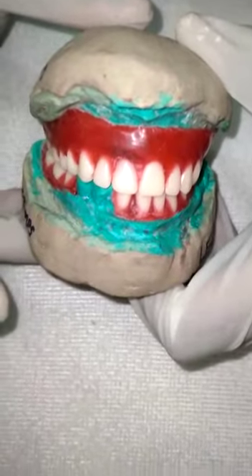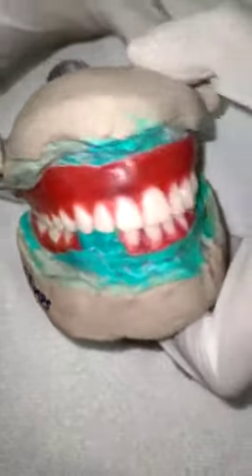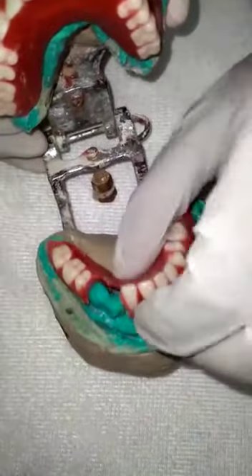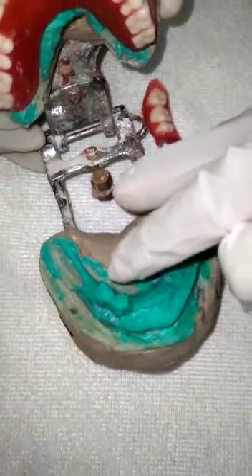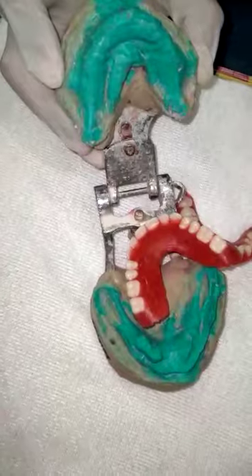I have made this wax try-in denture for my patient Leo M. Stamps. They have only two teeth remaining — a canine and first premolar — and the upper arch was completely edentulous. They have not recorded the palate area correctly.